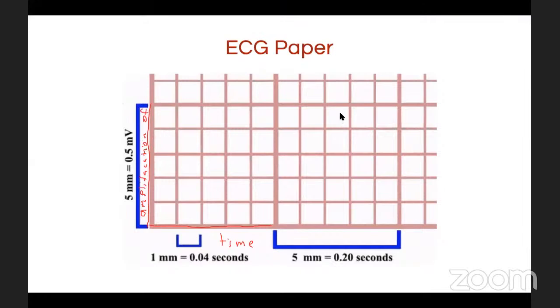the activity of the heart, of the electrical activity. Okay. طيب، الحين المربع الصغير هذا قلنا أنه time صح؟ طيب، كم مدته؟ نعرف منها كم المدة؟ 0.04 seconds. Okay.